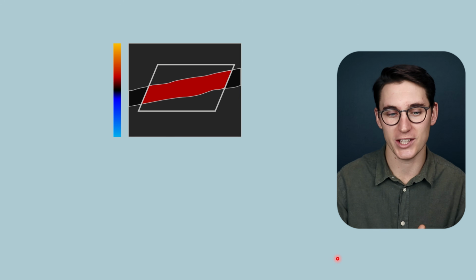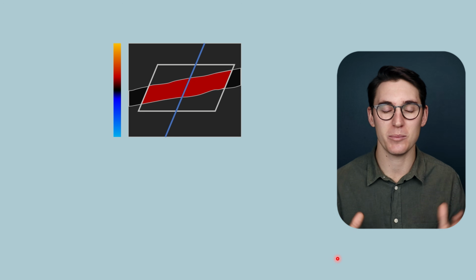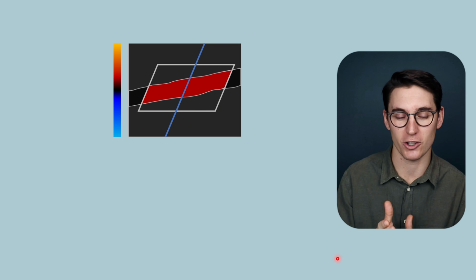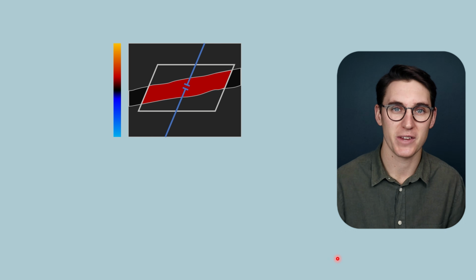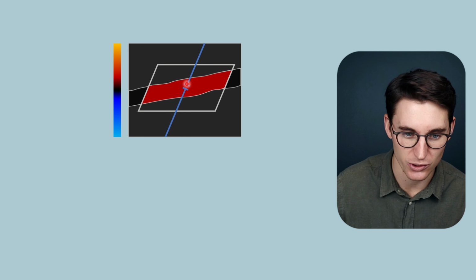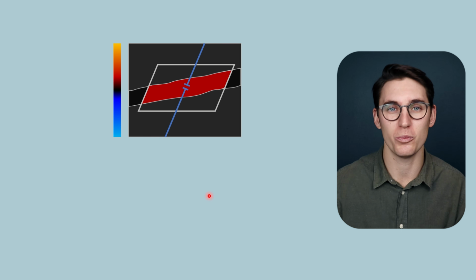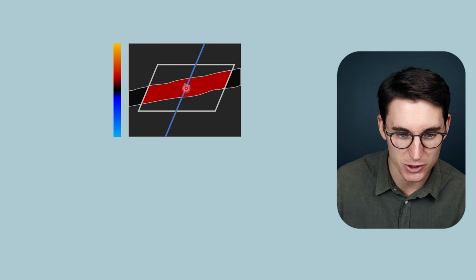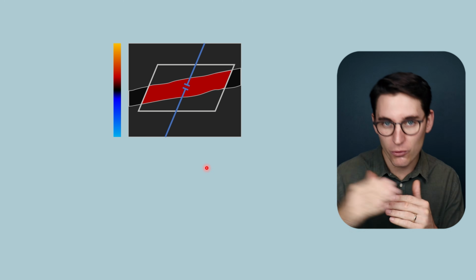The next thing we do is choose an A line of data, a single A line within this B mode image that we are going to use pulse wave Doppler in this example to create our spectral waveform. Once we've chosen that A line of data, we can then place what is known as a gate. Now, the gate specifies two things. It specifies the depth in the tissue that we want to image, and it specifies the volume of movement we want to image. The distance between these two gates here will be the area that we're sampling for the Doppler shift.